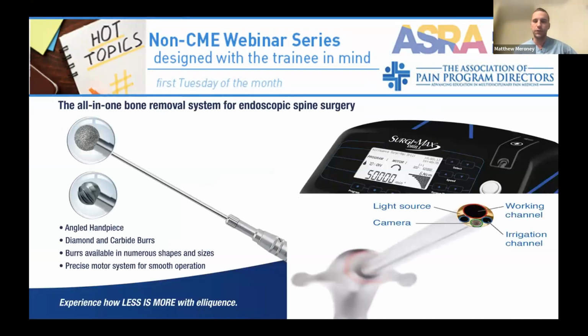I really like this procedure because, for one, it can be very successful for pain relief. It can be done on almost anyone, and it's a great, I would say, low stress way to get exposure to endoscopic to increase your skills, your hand-eye coordination, and just to get into the world of endoscopic, which is nearly limitless. So there's multiple tools.